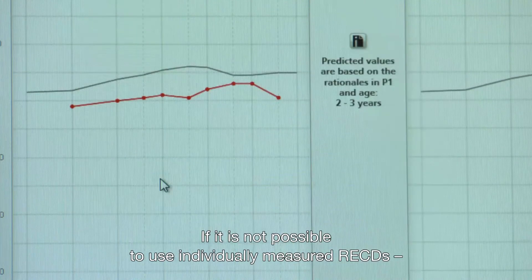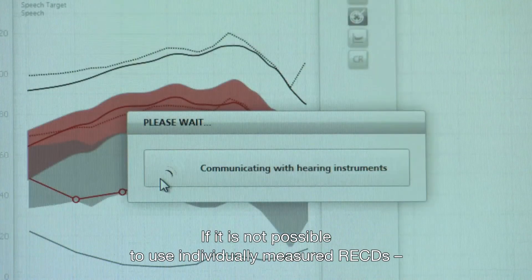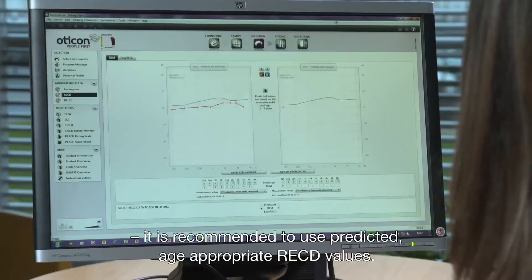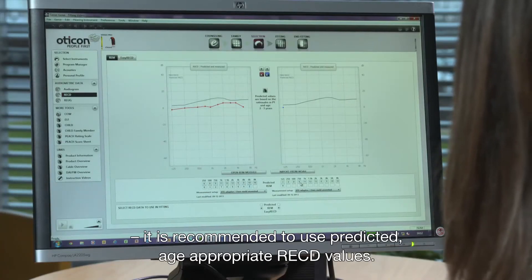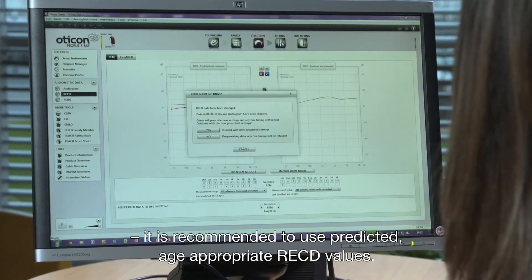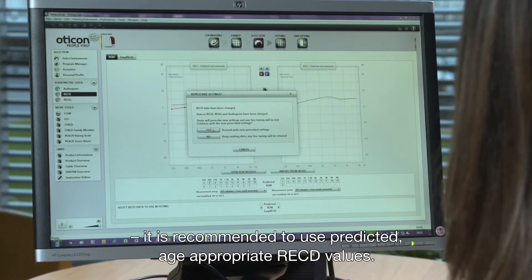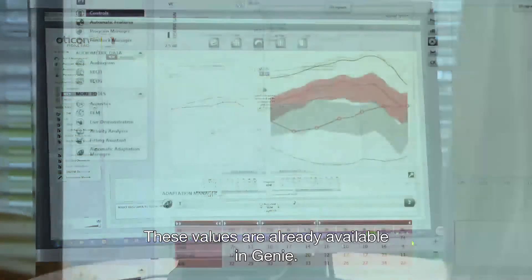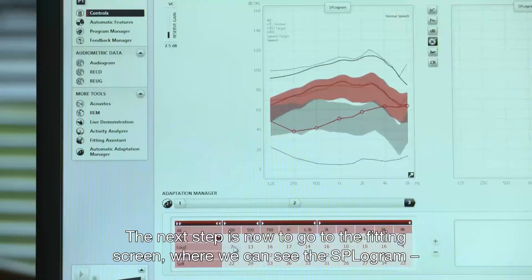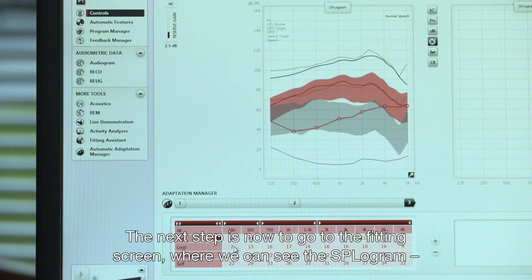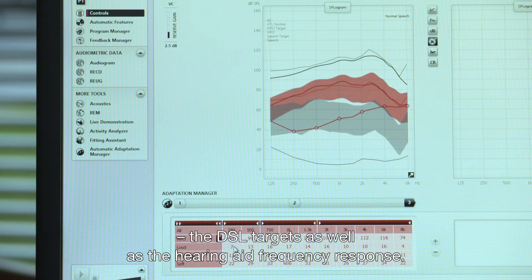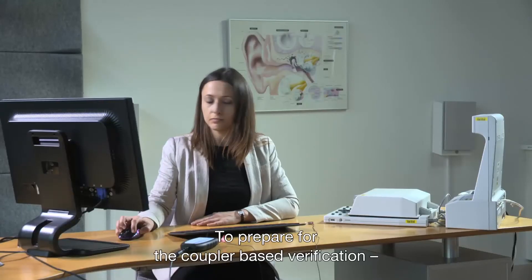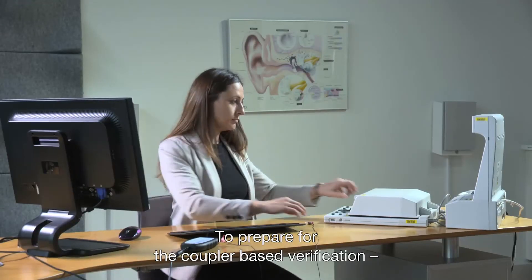If it is not possible to use individually measured RECDs, it is recommended to use predicted age-appropriate RECD values. These values are already available in Gini. The next step is now to go to the fitting screen where we can see the SPLogram, the DSL targets, as well as the hearing aid frequency response.